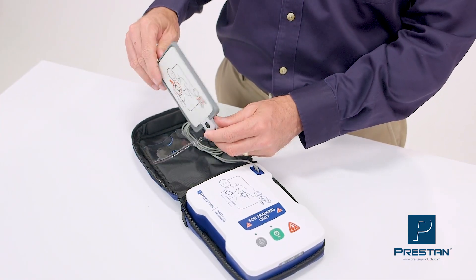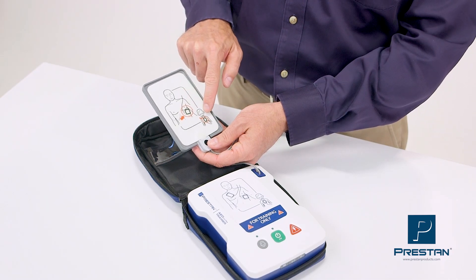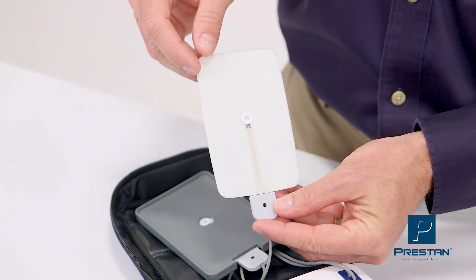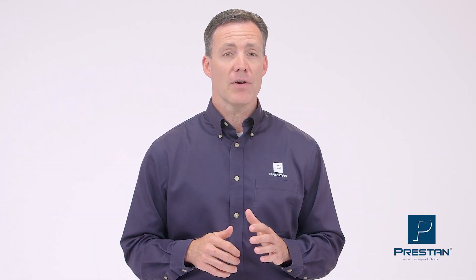The Prestan AED Ultra Trainer is equipped with a dual-graphic pad and Prestan's unique pad sensing system, which automatically detects when each pad is placed on the mannequin. This most accurately simulates a live AED, allowing for a more realistic training class.